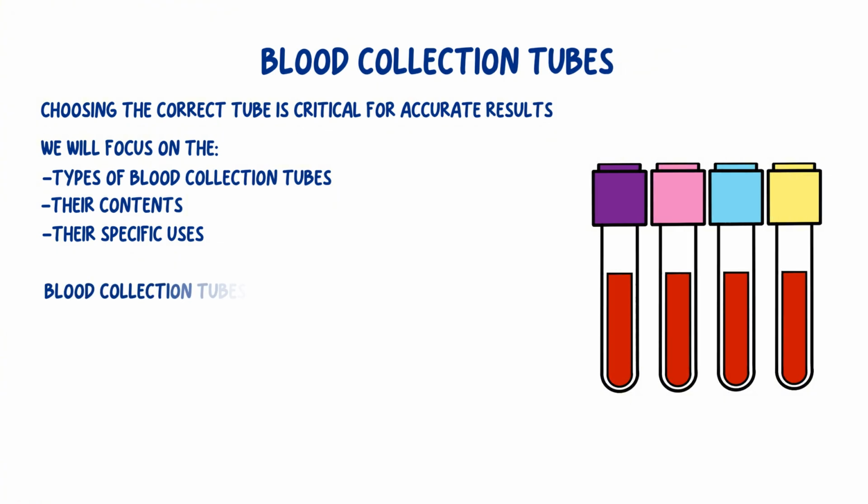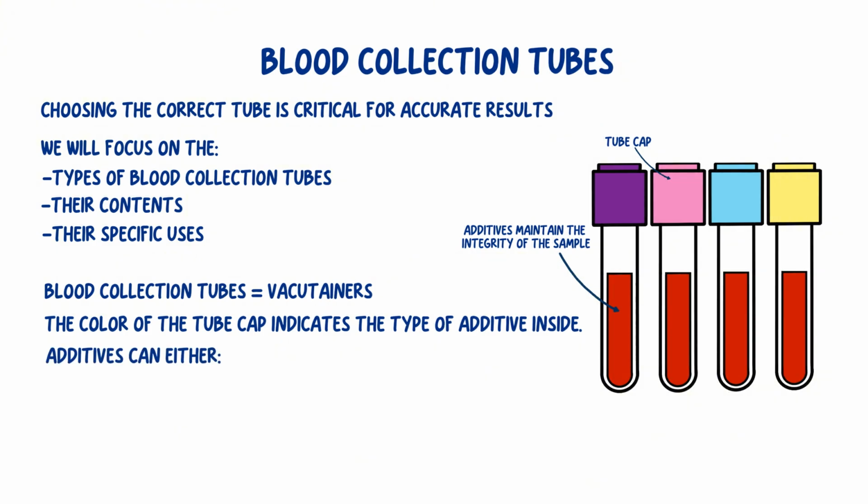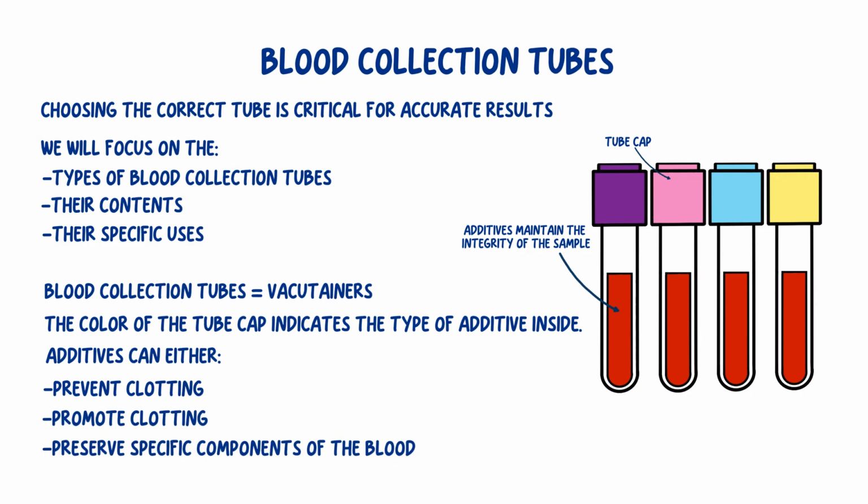Blood collection tubes, often referred to as vacutainers, are specialized containers essential for collecting and preserving blood samples for laboratory testing. These tubes come in various colors, with each cap color signifying a specific additive inside. These additives are crucial for maintaining the sample's integrity, ensuring accurate results for different types of analyses. Depending on the test requirements, these additives can either prevent clotting, promote clotting, or preserve certain components of the blood.